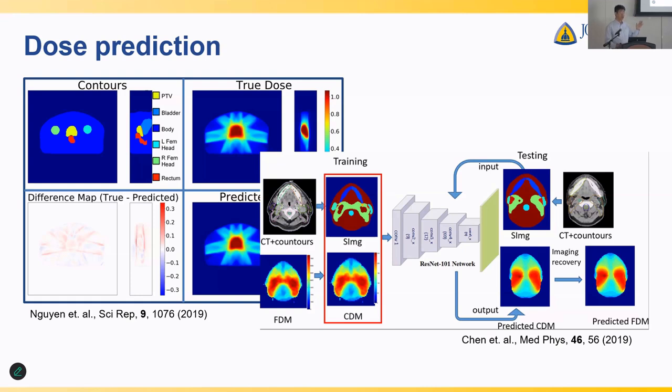This dose can be used to guide the treatment planning process. But the challenge is that this result only tells you what the plan should look like. It doesn't tell you whether this plan is achievable by the hardware or not. It just tells you this is the best plan. And further, this best plan may not even be realizable. It may be only good on paper.